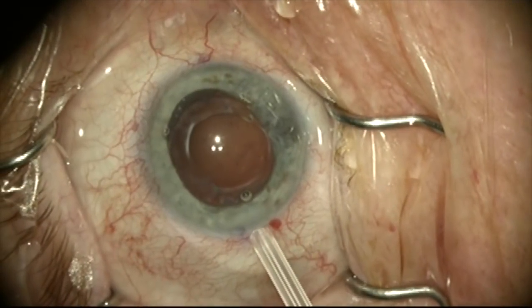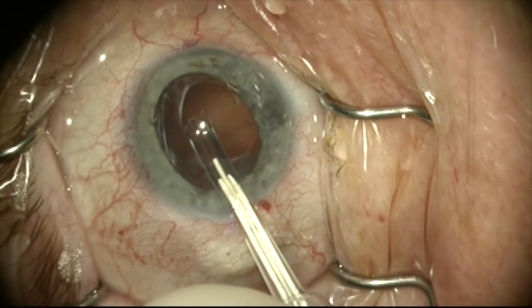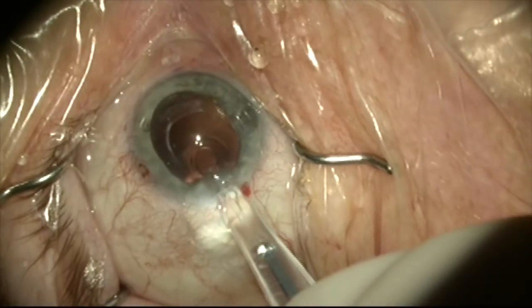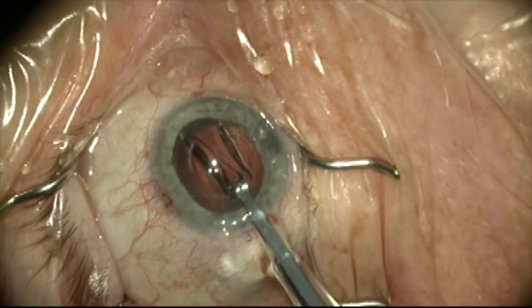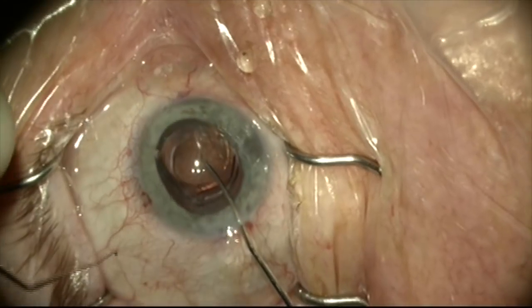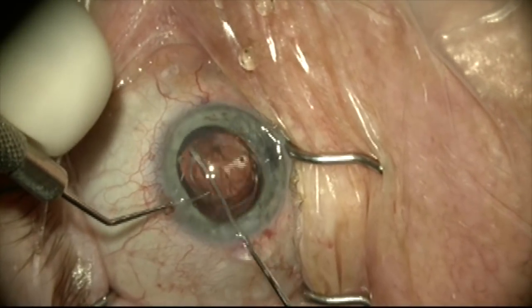I'm now going to place a capsule tension ring in the capsular bag to stiffen it up a bit and to make sure that we've dissected out all the way to the equator of the bag. This drops in nicely so I know that all the adhesions are freed up. We can now put the implant in the capsular bag — this is a Tecnis one-piece acrylic lens. We'll dial this into position after getting both haptics in the bag as gently as possible.